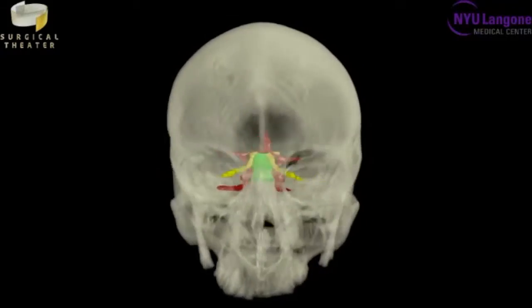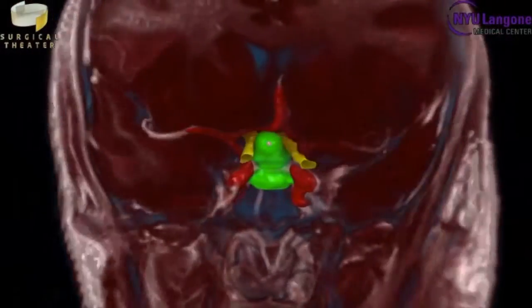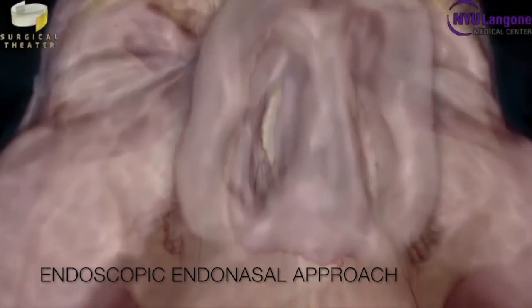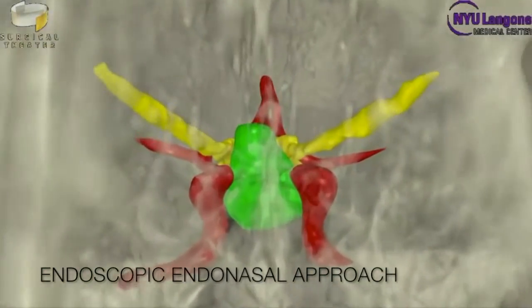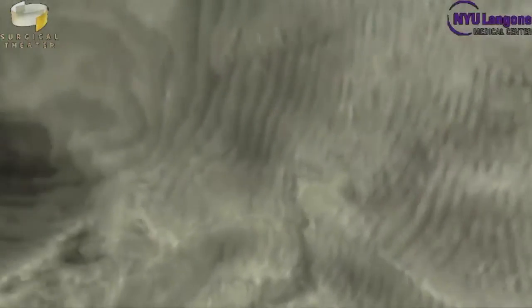We decided to offer her surgery because her headaches were quite unbearable, and she was also having endocrine symptoms, primarily amenorrhea. We did the surgery endoscopically using the transnasal transsphenoidal approach, and Dr. Leibowitz is my partner in this case.